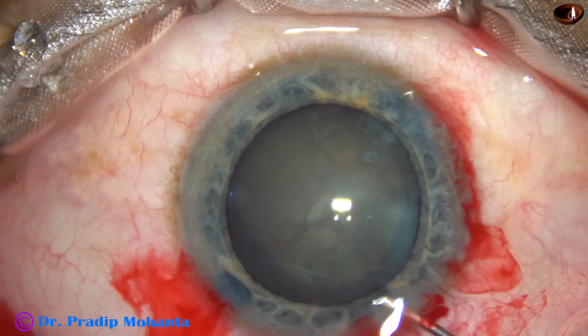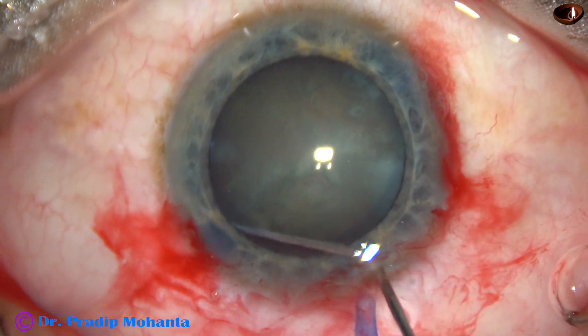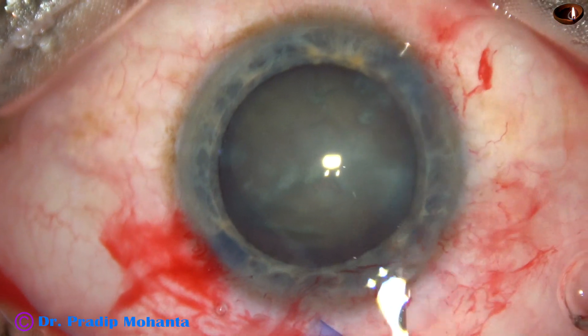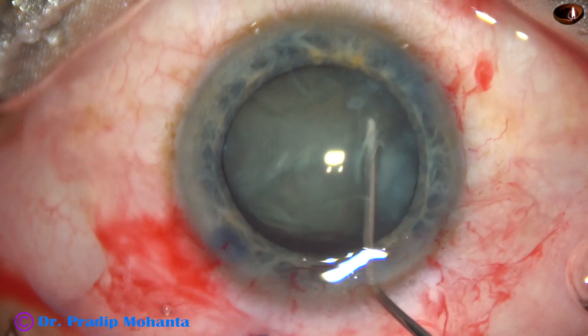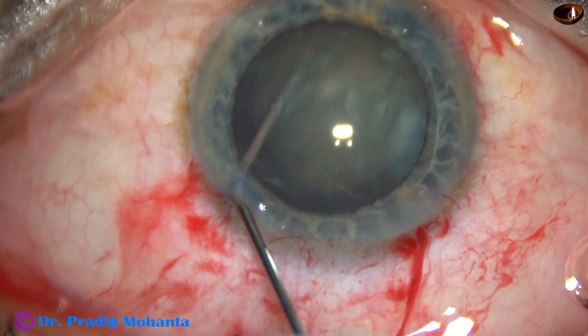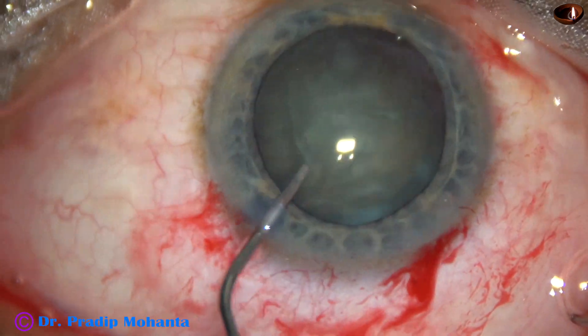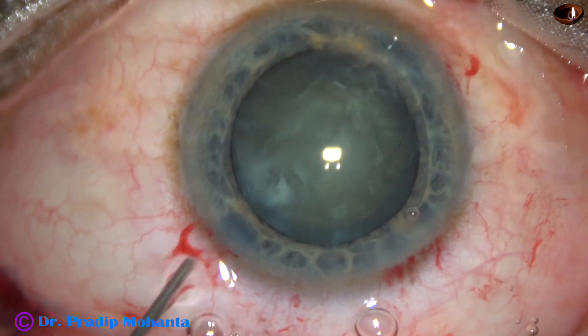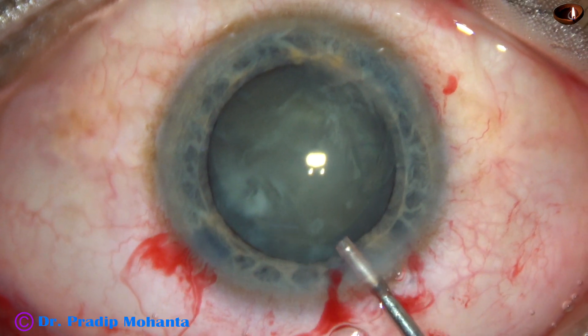Now, BSS is passed just under the anterior capsular rim. The nucleus is mobilized. The nucleus is tapped. The fluid behind the lens comes out along the equator.